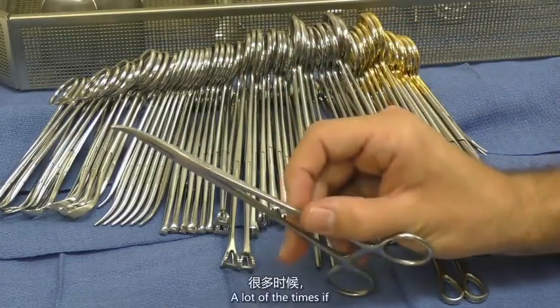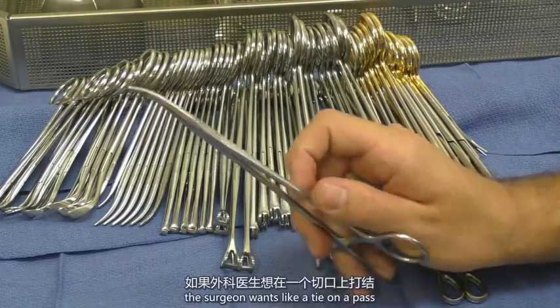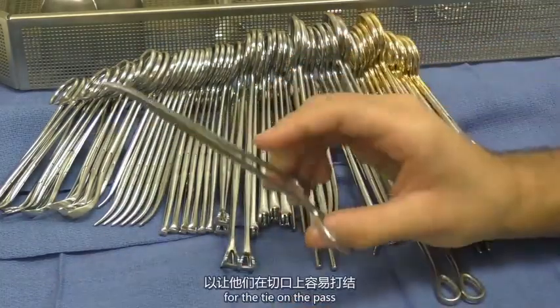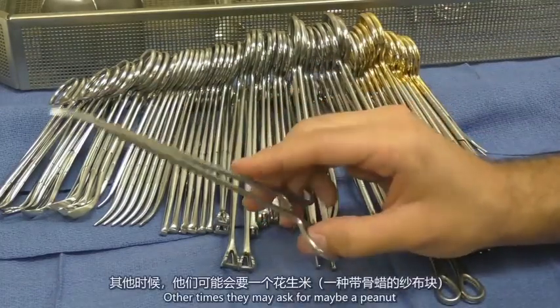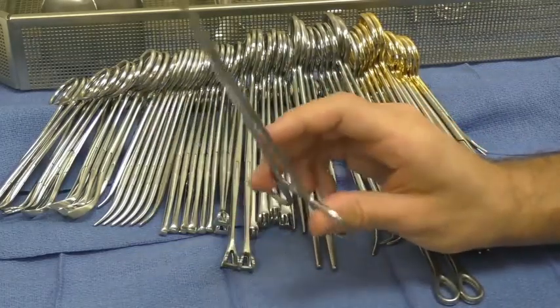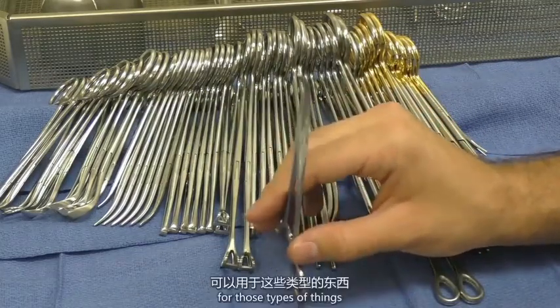A lot of the times, if the surgeon wants a tie on a pass, you will put the tie on a tonsil clamp for them to use for the tie on the pass. Other times they may ask for maybe a peanut, and this tonsil sponge will be used to hold that peanut. This is a good general use item for those types of things.